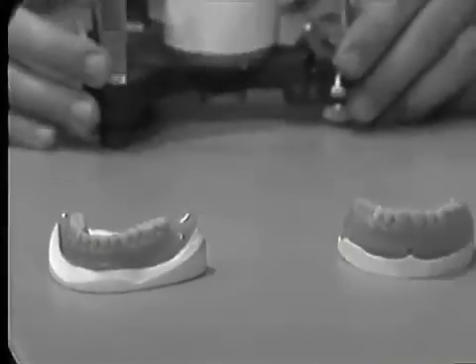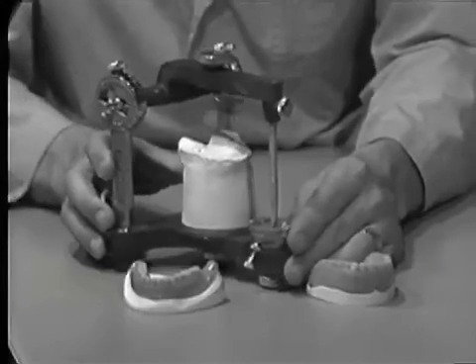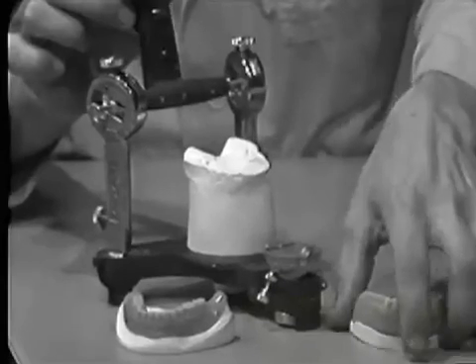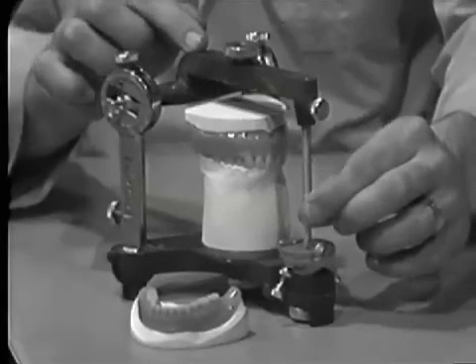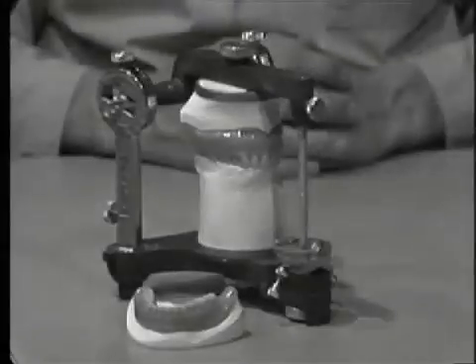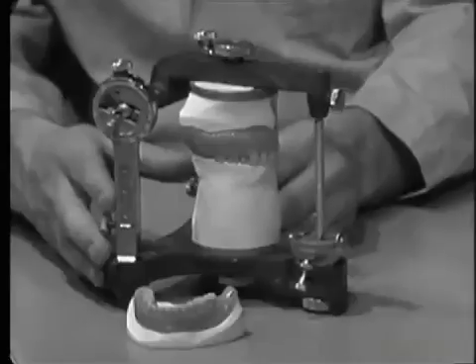Utilizing the remount cast, we are now ready to affix the maxillary denture to the articulator with the aid of an occlusal index. Wax check bites will then be taken to mount the mandibular cast and the denture in order to complete the occlusal modifications. Correction of minor errors in the original jaw relation records takes place during the patient remount. However, the methods and materials used for the patient remount may in themselves incorporate errors, and thus a great deal of care must be taken while performing this procedure.